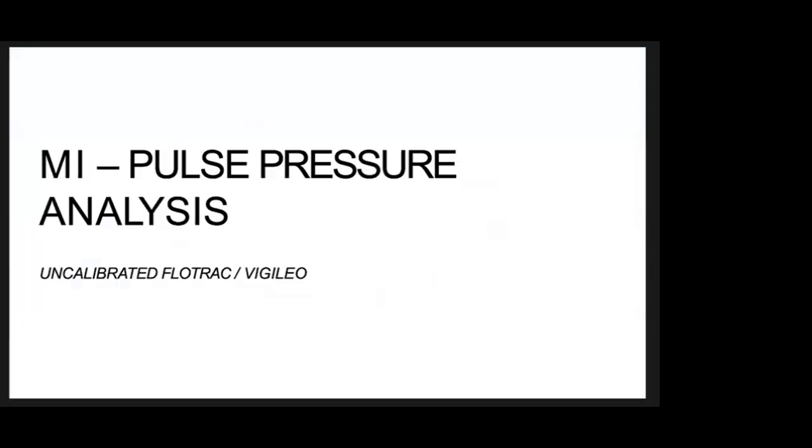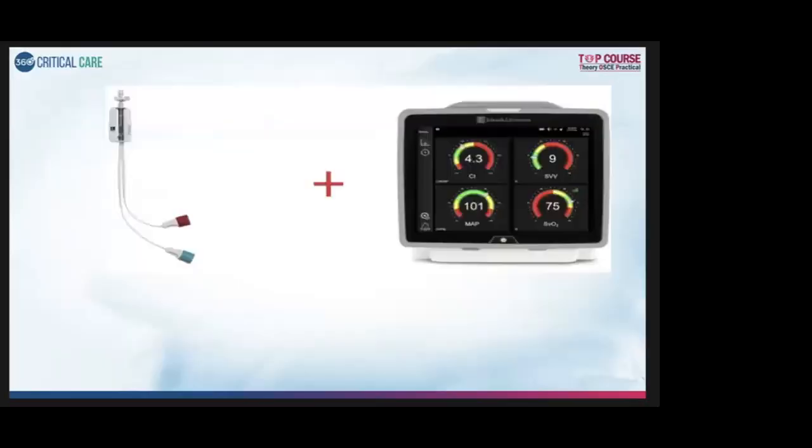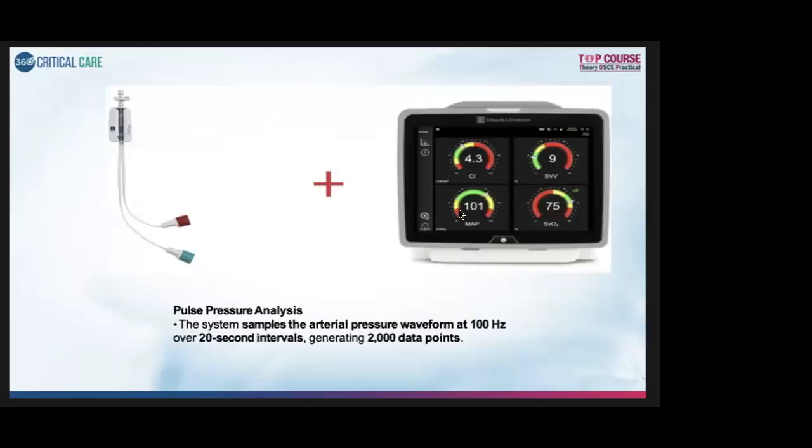Okay, coming on to the next minimally invasive technique, which is uncalibrated, is the pulse pressure analysis, which is used by FloTrac. Basically, the FloTrac is the arterial line sensor which we attach to the arterial line, and Vigileo is the processing and the display monitor which we see. So this is the FloTrac and the Vigileo monitor. Here, pulse pressure analysis is the basic mechanism where the system samples the arterial pressure waveform at 100 Hz over 20-second intervals, generating 2000 data points.